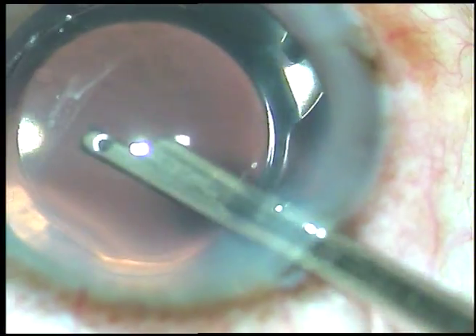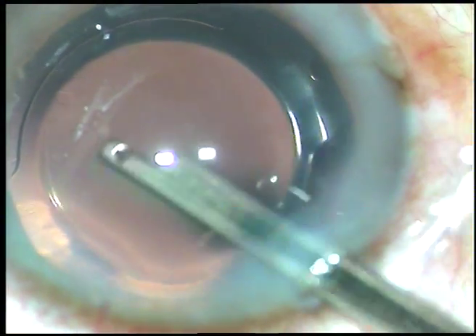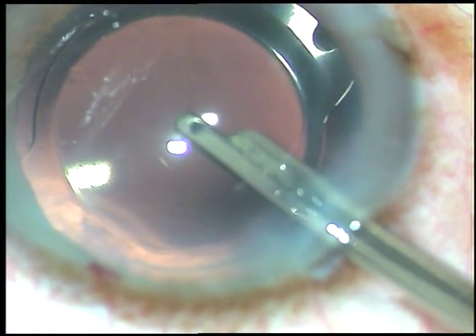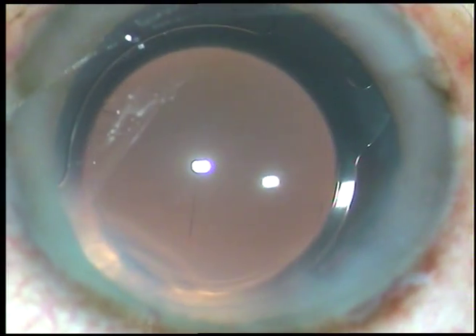The anterior chamber is now formed nicely and the case is concluded. Thank you very much for your attention. Hope this video will help you in developing your surgical skills. You can learn bimanual IA and the stop and chop technique of phacoemulsification. Thank you very much.